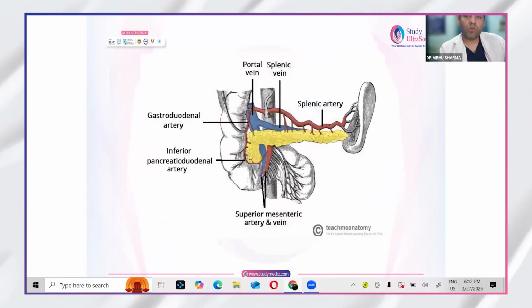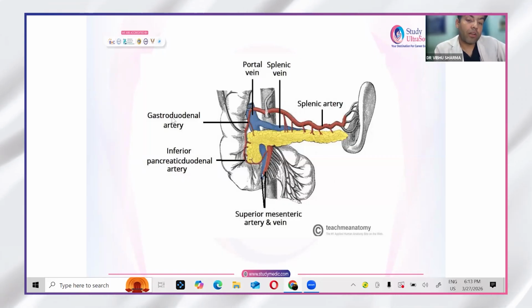You should also know the structures which are adjacent to the pancreas. Inferior to the pancreas are the superior mesenteric artery and vein, the SMA, which you can see here along the inferior wall, whereas the lateral wall shows the pancreaticoduodenal artery. Above it is the gastroduodenal artery.